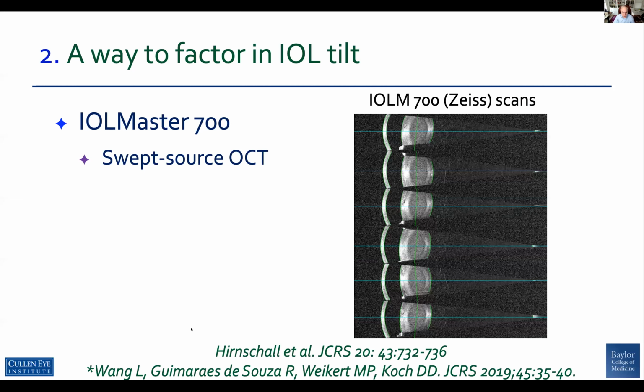And Rodrigo, our fellow, was very involved in this study with us. And we used the IOLMaster 700 swept source OCT. And unfortunately, these are images from the IOLMaster 700. You cannot get these out of the device. You have to send the data to Germany. So it's not available for clinical use.